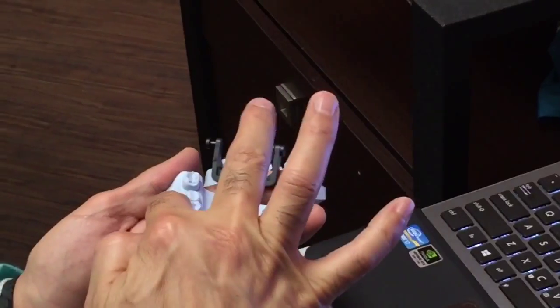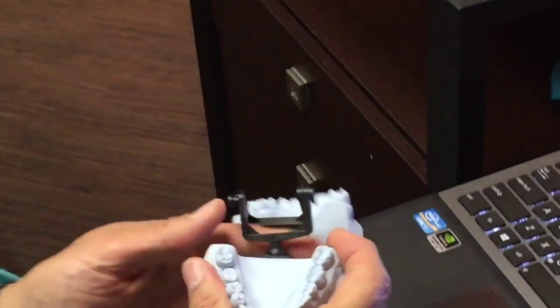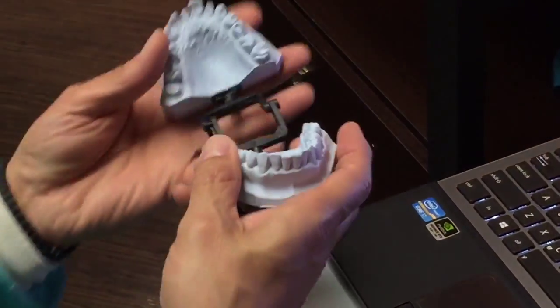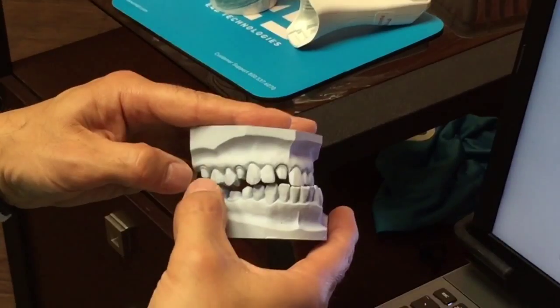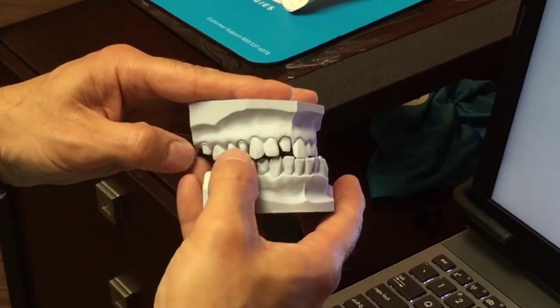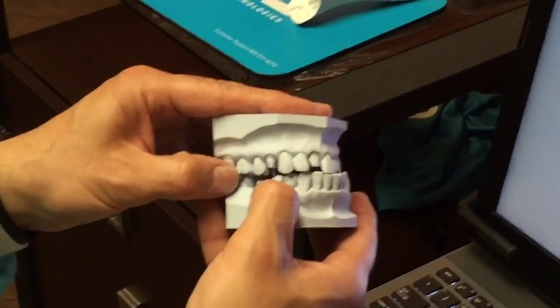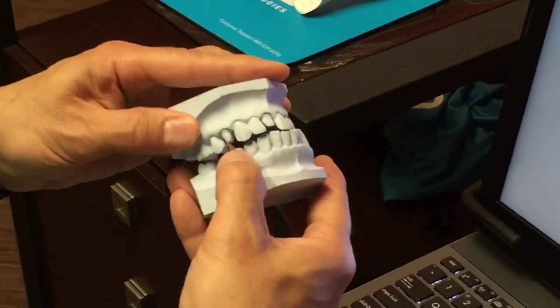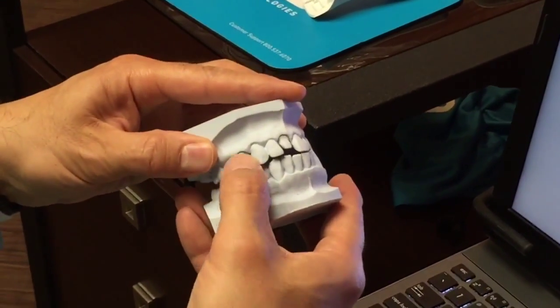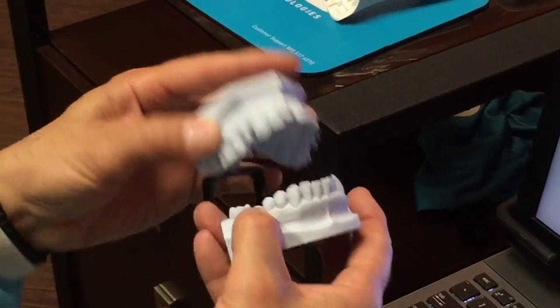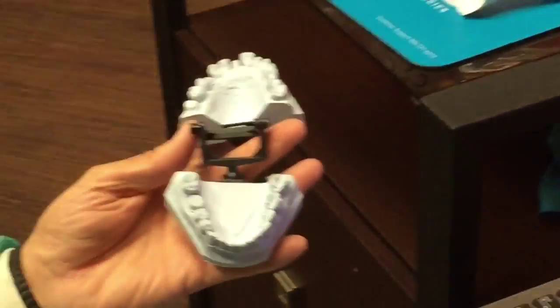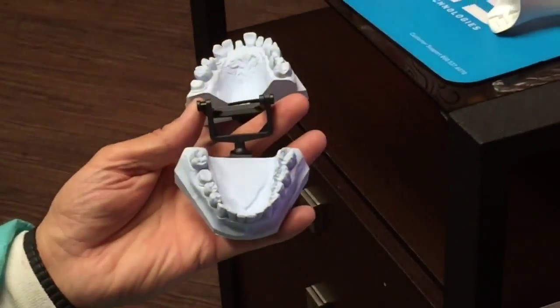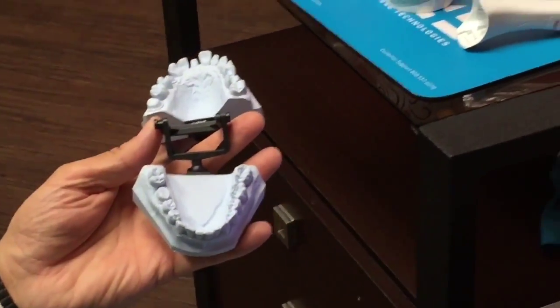Once you scan the prep, then the teeth that superimpose on those three teeth would be 3, 4 and 5. You scan the opposing, and then you have to scan the bite. That's all you do. It'll guide you to what areas to scan.